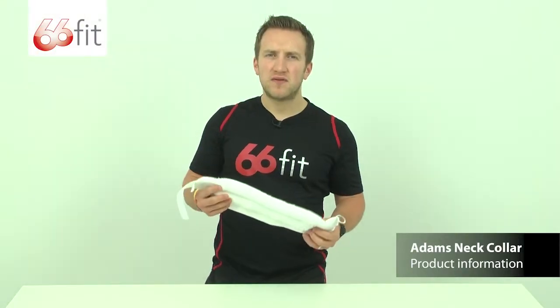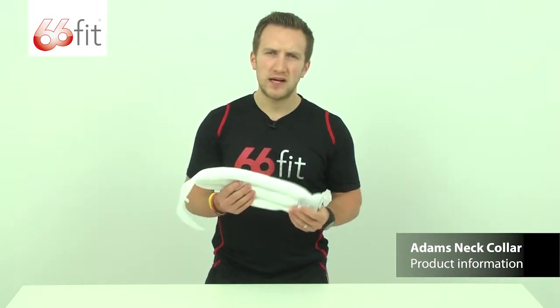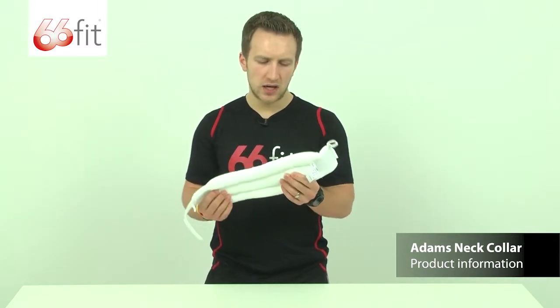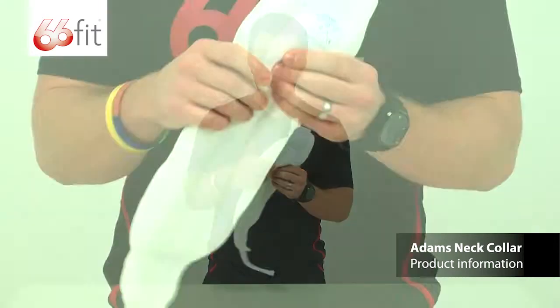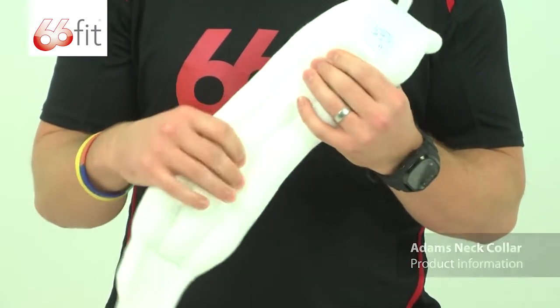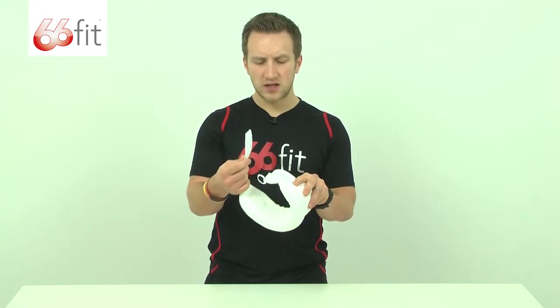This is the Adams neck collar provided by physiosupplies.com. It comes in three sizes: a small, medium and large, this one here being a large. It's made of a breathable cotton outer layer, it's got moldable polystyrene beads on the inside, and it's got this easy to use hook and loop fastening system here.